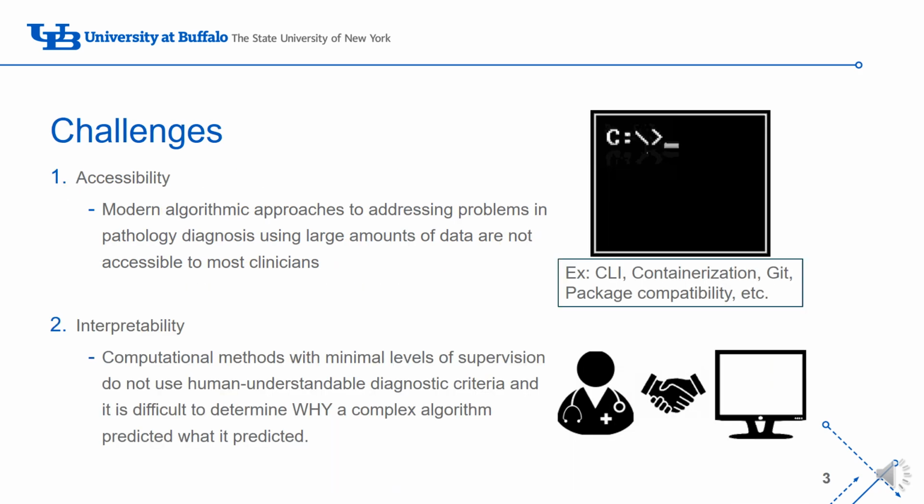One of the first major challenges in the incorporation of computational methods in a clinical setting is the lack of accessibility of most high-powered algorithms to clinicians. This includes any method that requires use of the command line interface, adjusting source code to fit local setups or data locations, or setting up containerization methods like Docker, etc.